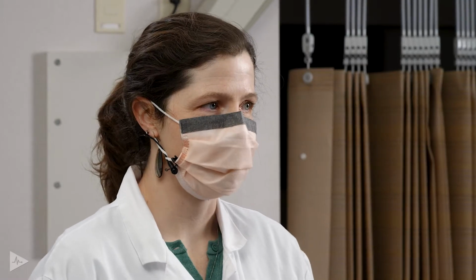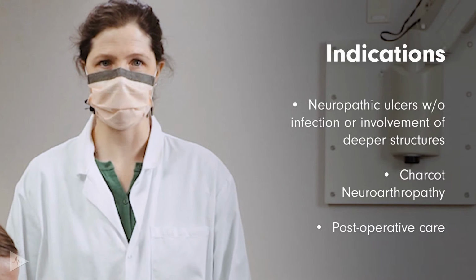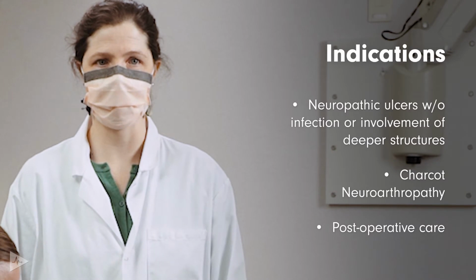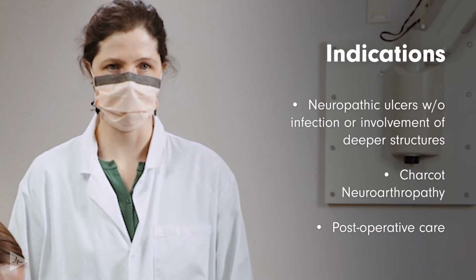Total contact casts come in many different options. We use a non-removable cast, but there are some options that have a removable version as well. There are indications for and contraindications to total contact casting. So like I said, diabetic ulcers are the main indication for total contact casting, but it can also be used in Charcot-arthropathies and postoperative care.